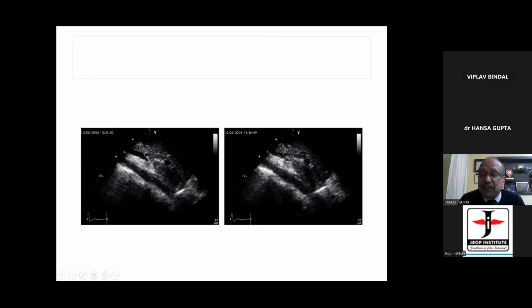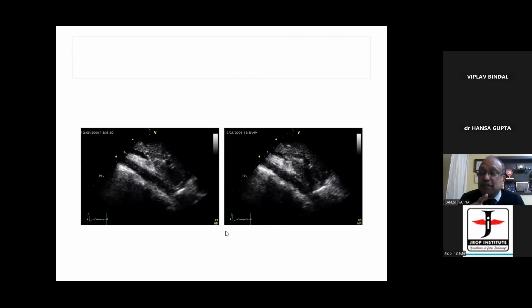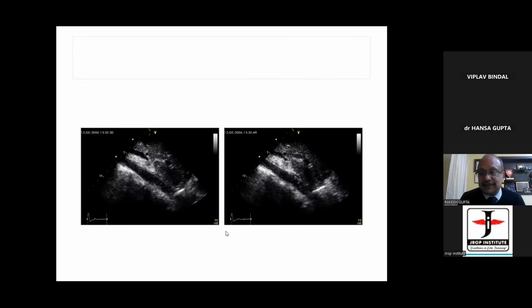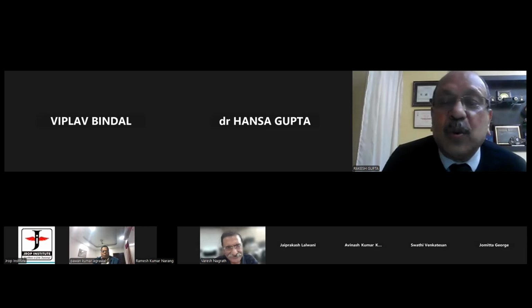So that is the power of a contrast echo in day-to-day practice. I can show you an aortopulmonary window with pulmonary artery hypertension, where the blood is going from pulmonary artery to aorta. So finishing up with this slide presentation, one large slide I just wanted to show and stop before it.